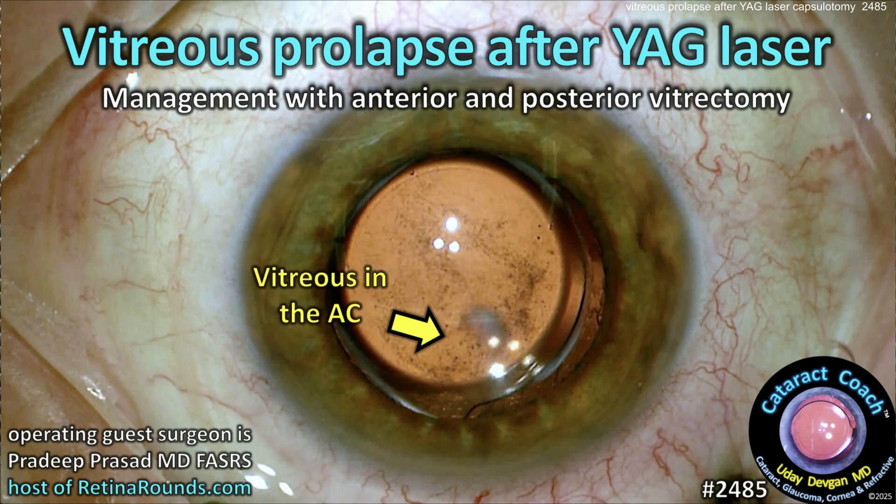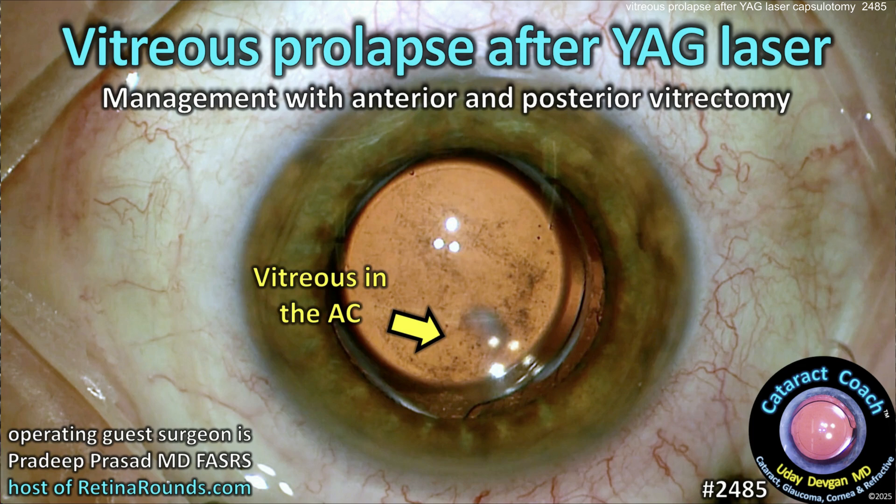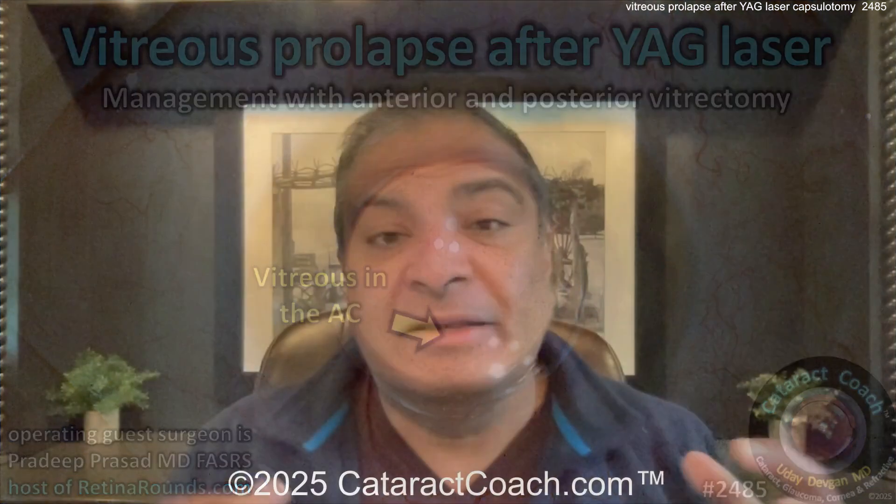cataractcoach.com — vitreous prolapse after YAG laser capsulotomy. Now you've got vitreous in the anterior chamber and prolapsing around the optic. What are you going to do in this tough case?